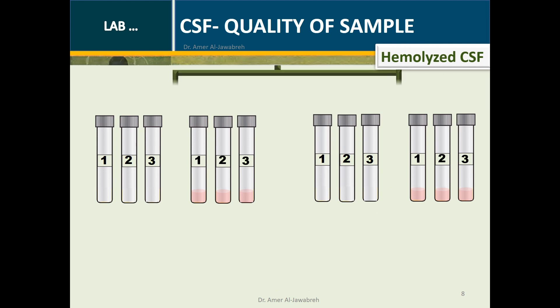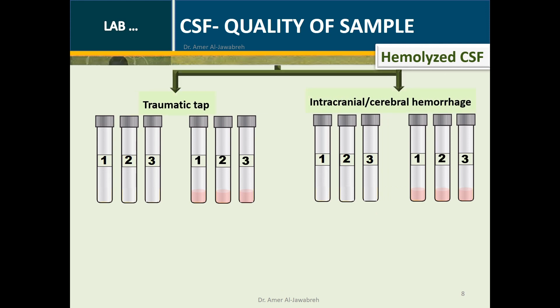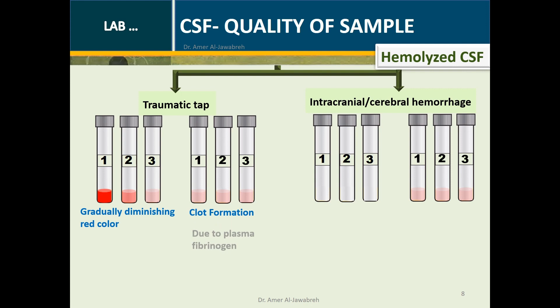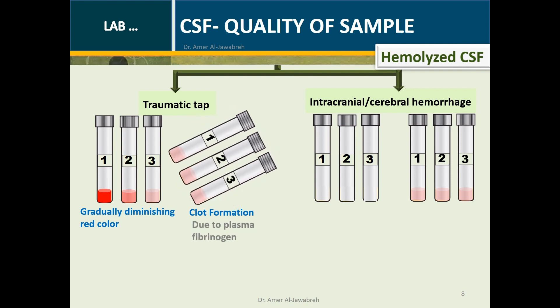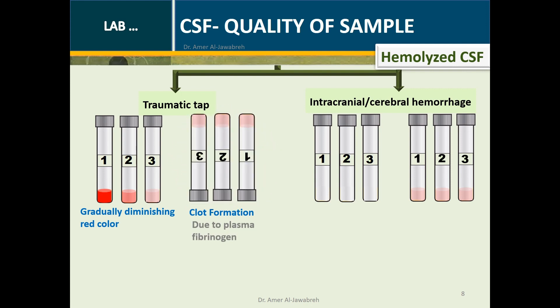Quality of CSF sample — Hemolysis: caused by traumatic tap or hemorrhage. Traumatic tap is viewed as gradually diminishing red color across the three tubes, or clot formation due to plasma fibrinogen. Hemorrhage is viewed as evenly distributed red color across the three tubes, or the absence of clot.